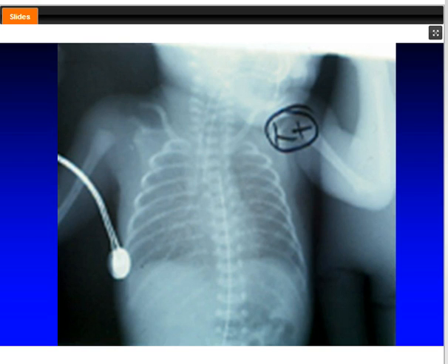And here we have a baby who again has developing chronic lung disease. The problem with this baby is you look at the baby and say, oh, baby's overinflated, wean the mean airway pressure. But that's not the issue with this baby. This baby is on too fast a frequency because as the airways develop problems with chronic lung disease, you get an airway issue and fast frequencies tend to air trap.